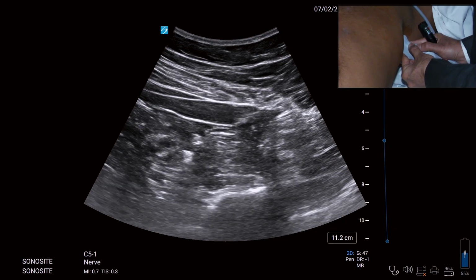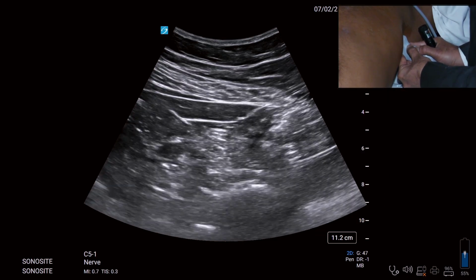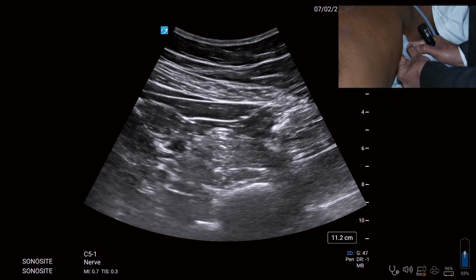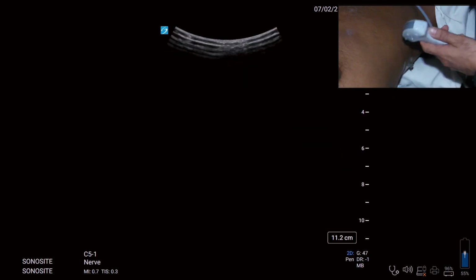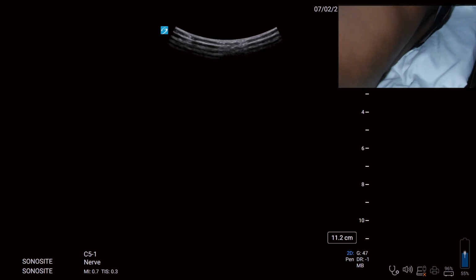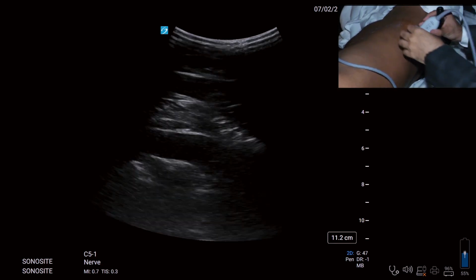So the lateral QL would be on the lateral side. Anterior QL would be between the psoas in this plane. Posterior would be posterior. So ideally, if I have to do it, I would turn him laterally. Turn on your side once. Then the appearance of quadratus lumborum is going to change slightly, but we will be able to recognize the thumbs up sign.